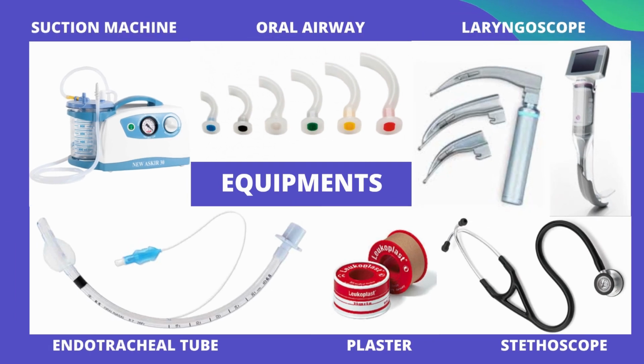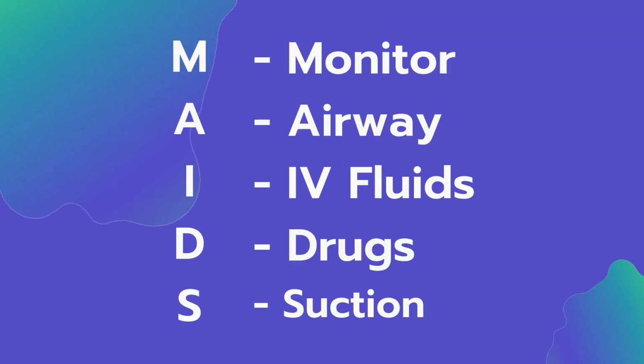Instruments used: suction, airway, laryngoscope, endotracheal tube, plaster, stethoscope. Also remember the mnemonic MAIDS: cardiac monitor and pulse oximeter, airway, IV fluids, drugs to be given, and suction.